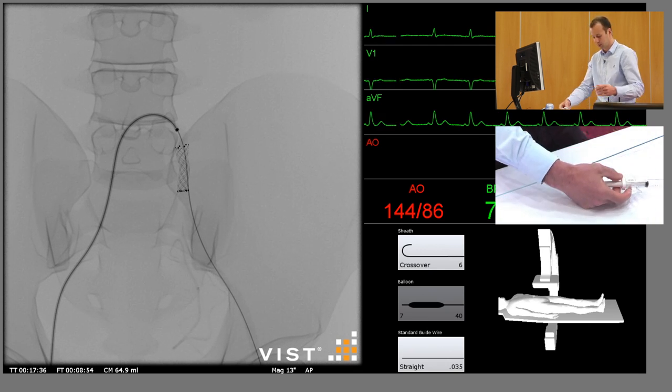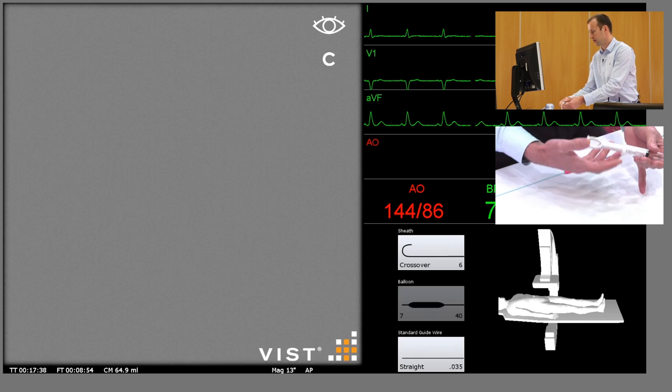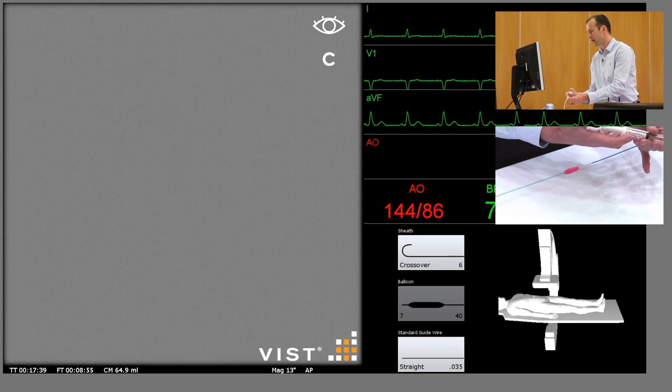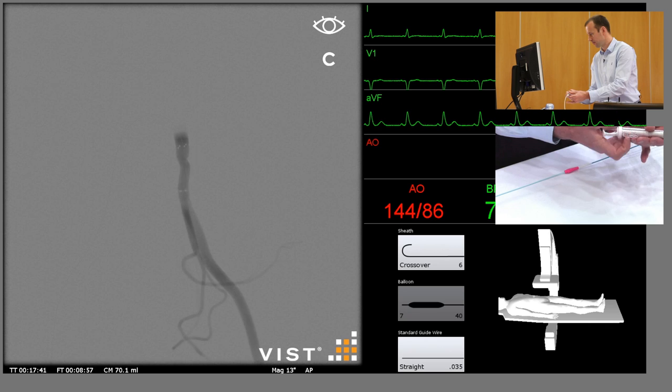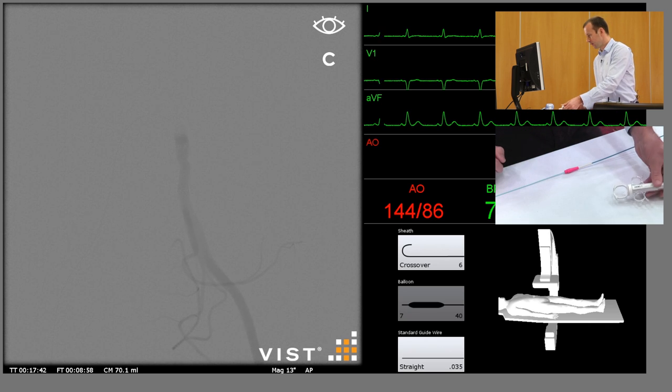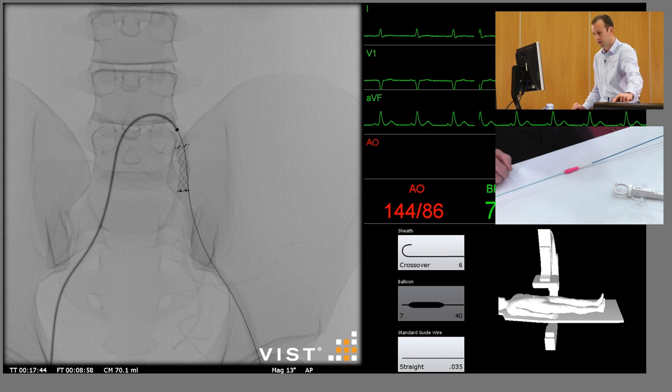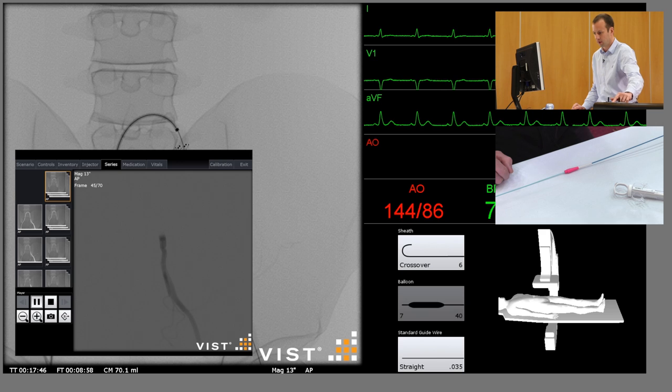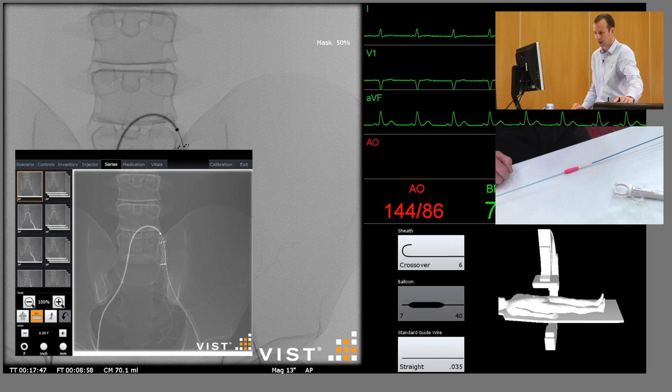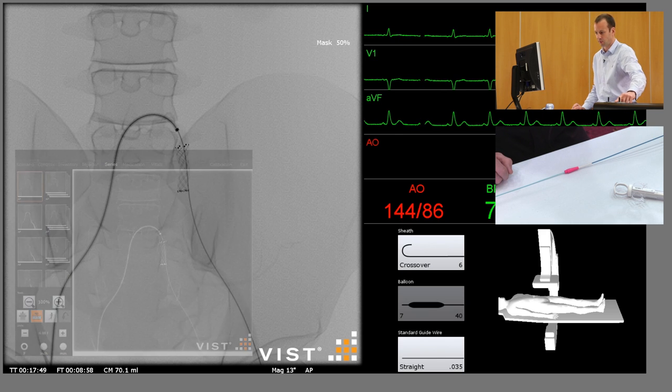Again, a high quality subtracted angiogram, and this will demonstrate a well treated lesion with minimal residual stenosis.